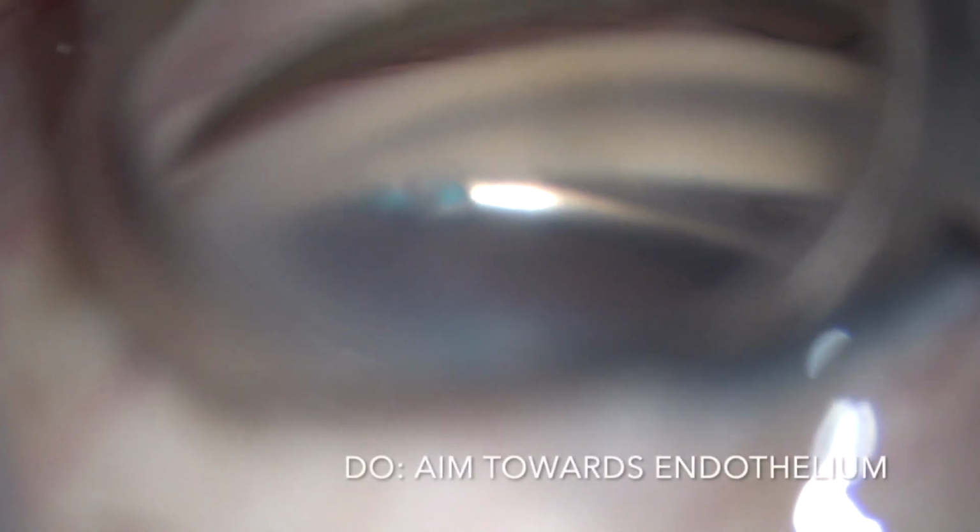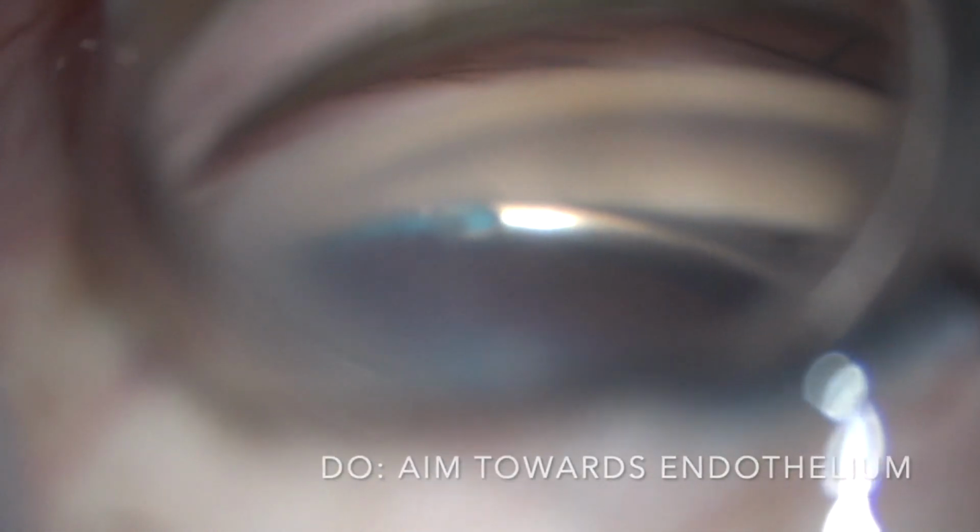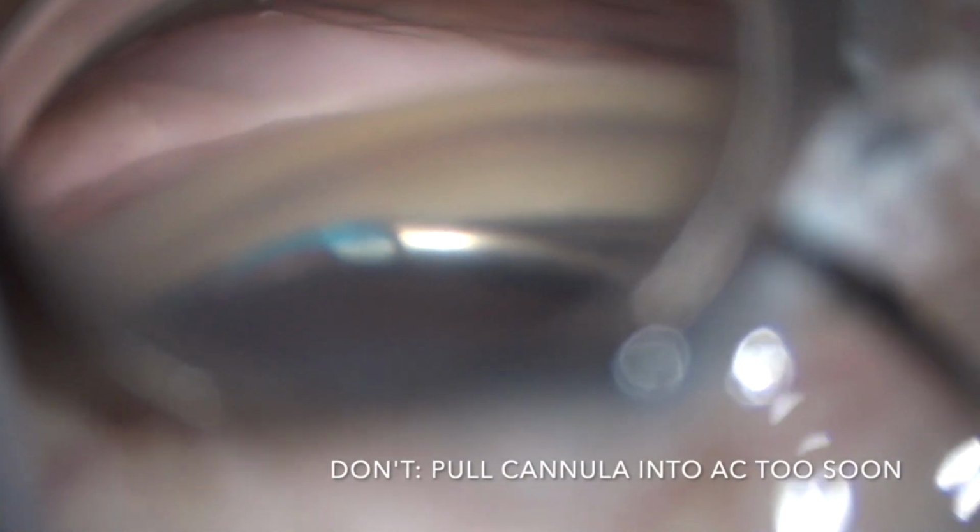Here I have reformed the eye with OVD, and I'm going back again, bringing the cannula across the eye, piercing the trabecular meshwork, and then most importantly, right there, aiming anteriorly towards the corneal endothelium. That will really ensure that the microcatheter goes straight into Schlemm's canal and does not go downwards, potentially into the iris. You also want to make sure that you don't pull the cannula into the anterior chamber too quickly. You want to keep the tip of the cannula close to the trabecular meshwork.